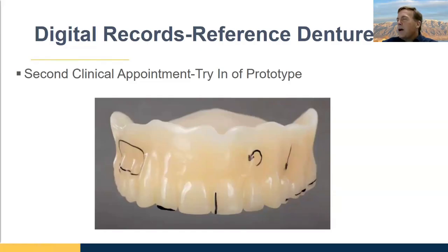This is a good time to talk about post-dam. Remember, the point of a post-dam is to make up for polymerization shrinkage on a traditional process. So you have to decide if you want a post-dam or not. I haven't really heard a consensus.